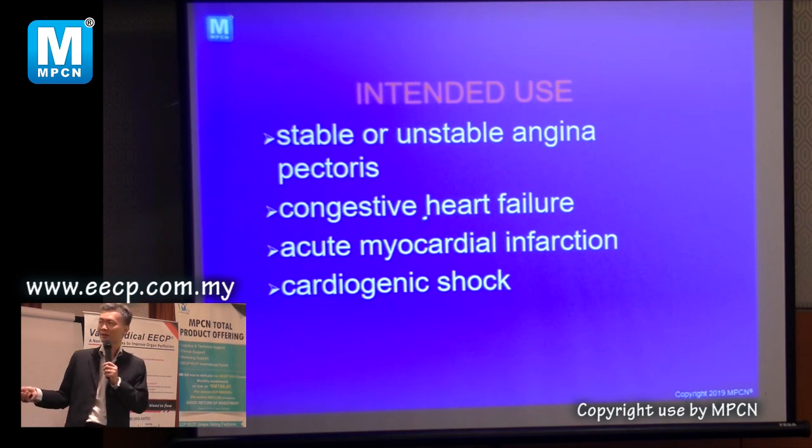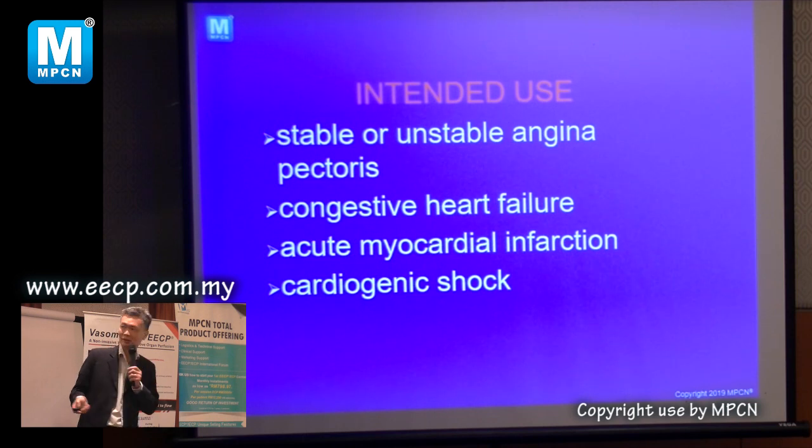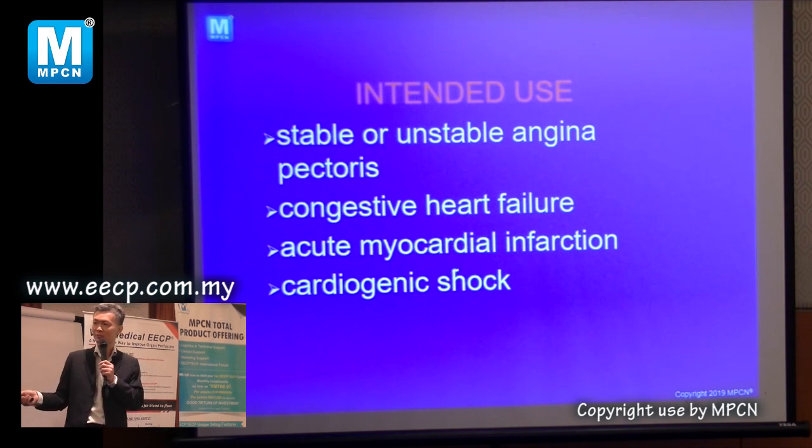Heart attack, according to the indication, it can be used, but we don't use it because when they have a heart attack, they are very unstable. So if something happens, they will blame it. This machine caused a problem, so we don't really use it.